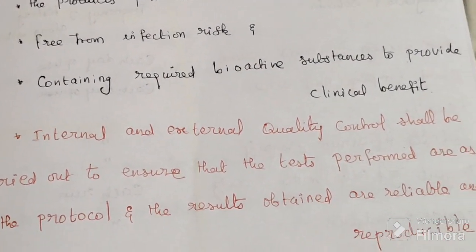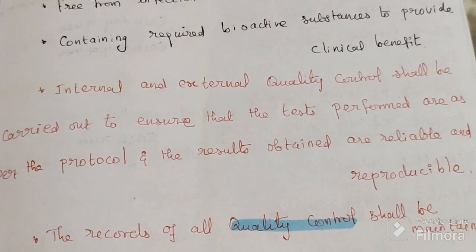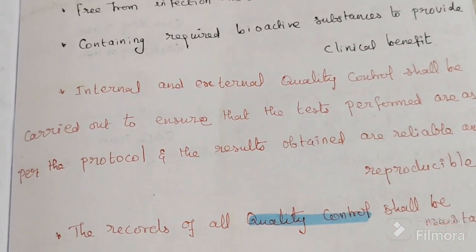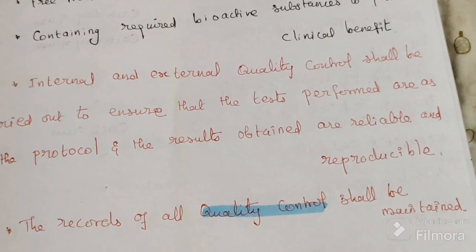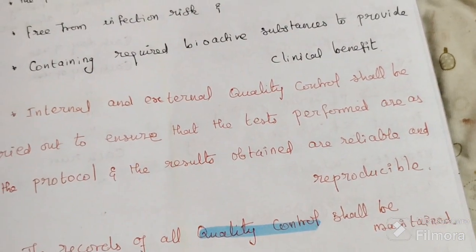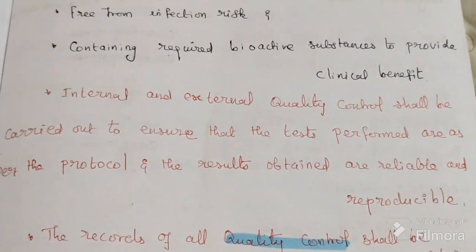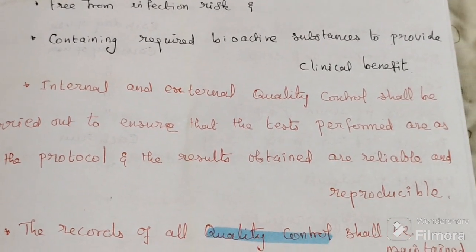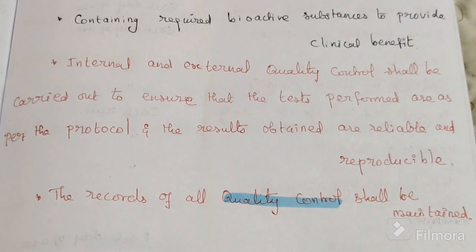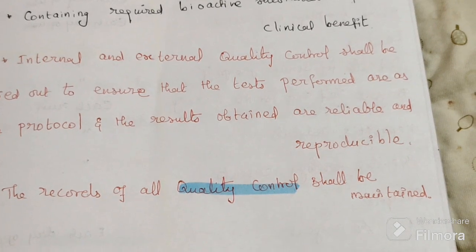Internal and external quality control should be carried out to ensure that the tests performed are as per the protocol and the results obtained are reliable and reproducible.